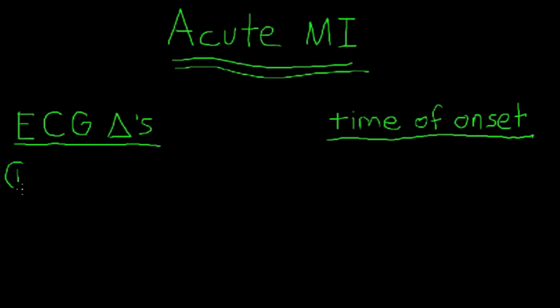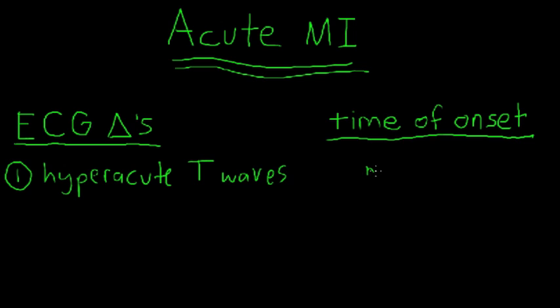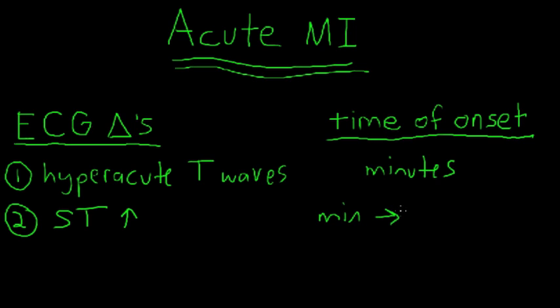ECG Burst Part 5. During the course of an acute MI, when do large upright T waves usually occur? Large upright T waves are usually the first manifestation of acute MI, and they occur within minutes, and they last minutes to hours. ST segment elevation usually develops in minutes to hours, and Q wave abnormalities usually develop in hours to days following acute MI.